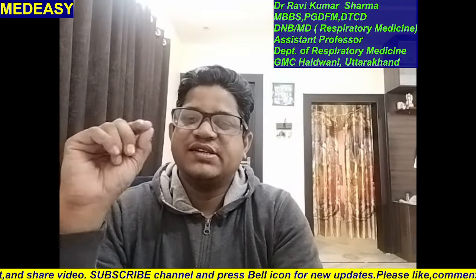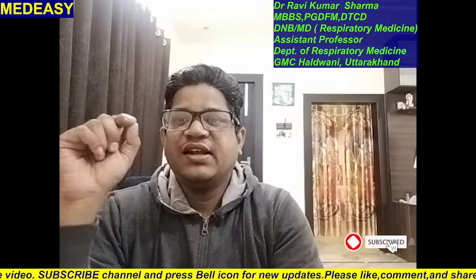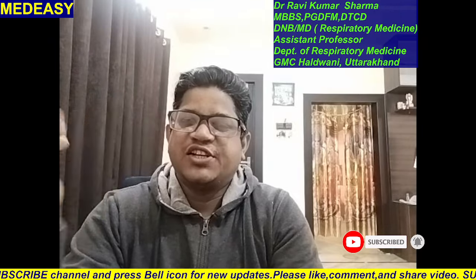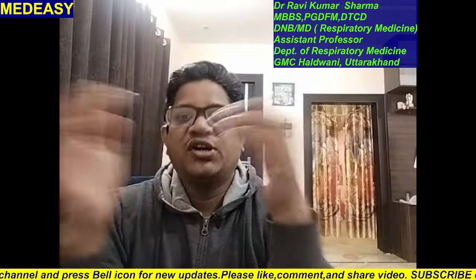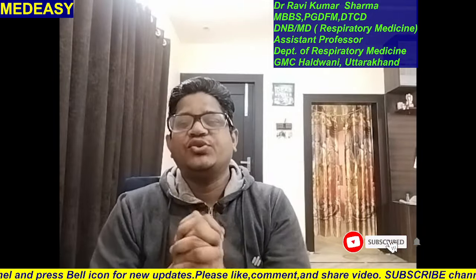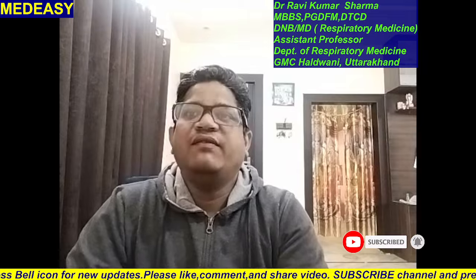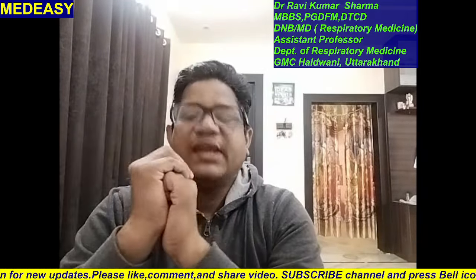Today we will discuss a very interesting image that we have seen recently in our OPD. It's a classical case of pneumonic consolidation, and the classical description of pneumonia is hepatization, where the pulmonary parenchyma or lung tissue is replaced by a tissue that has a consistency similar to your liver because of the inflammation and inflammatory exudates that fill the air spaces.